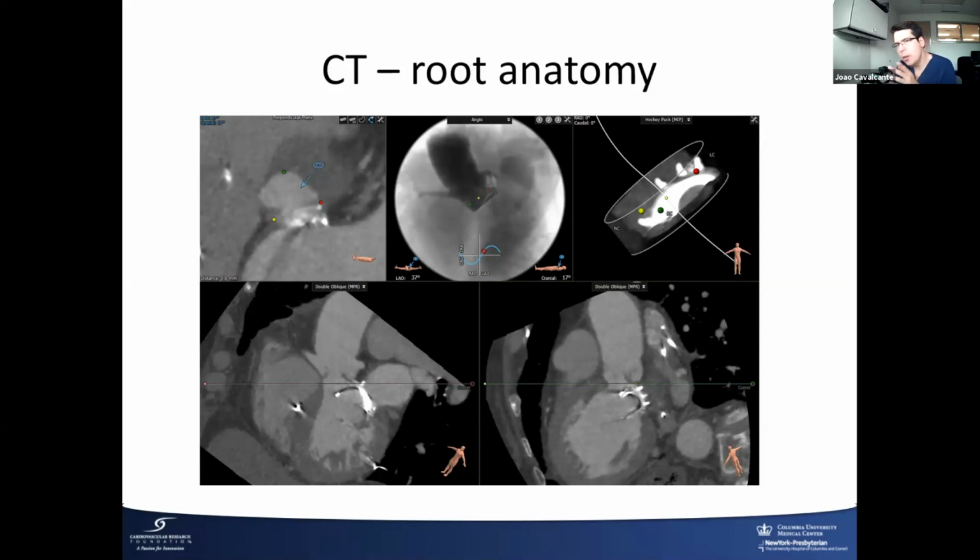Sorry, go ahead, Joel. No, so how long ago was the mitral valve surgery done? 2016. I wonder if there is something anatomically wrong that might have pulled some of the aortic cusp, because the jet is so eccentric. We have another slide that the leaflet might be restricted, and really frozen. AI can be tolerated for quite some time, as a valve disease where the ventricle is already dilated. Good point. I think what happened was most likely they oversewed and pulled on the intervalvular fibrosa, and that is connected right where their picture is, and that's likely causing the AR.